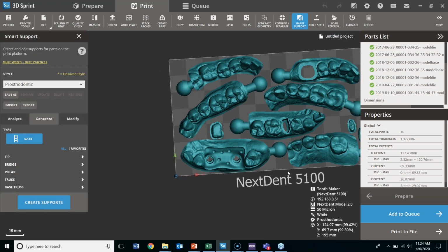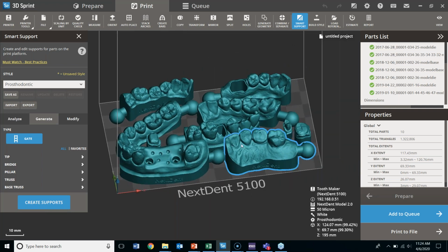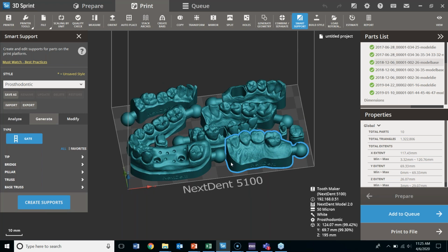Adrian? Yes? I had just a question really quick. Somebody was wondering, what does part normal fix do? That's actually for geometries that are not organic. So I would not use part normal fix. It's actually for like aerospace parts and things like that. So always never use that one. Okay. And then they also wondered if there's a hotkey PDF file available. Yes, and I'll put a shortcut to it into the presentation, but you can click here in help and it'll bring you to a hotkey list as well. Awesome, thanks.